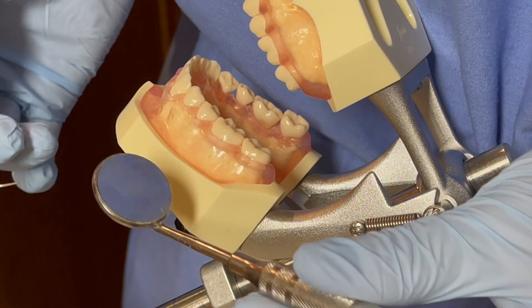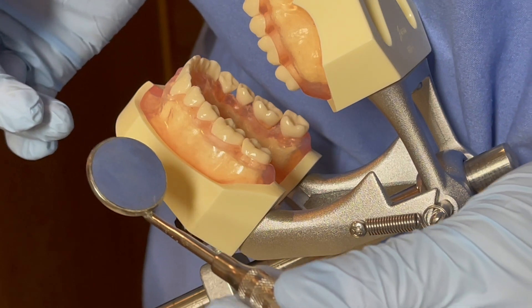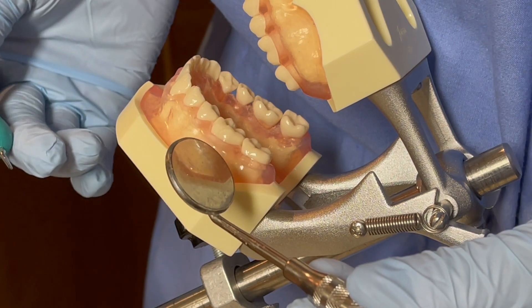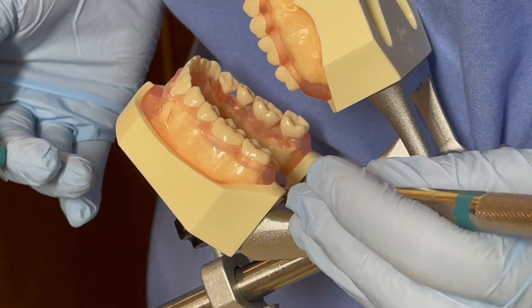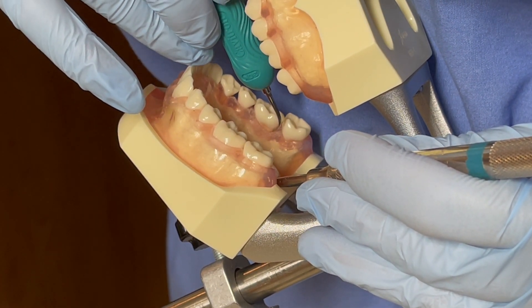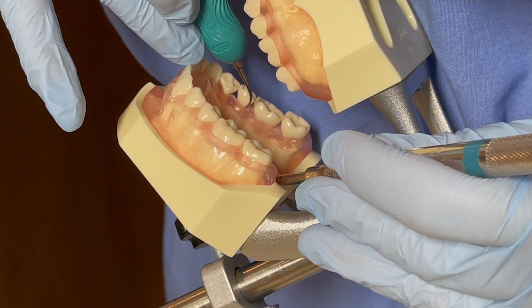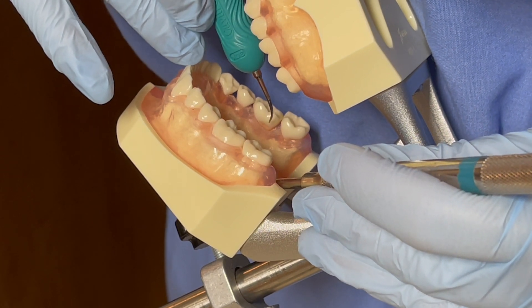For number 29-30 lingual aspects, I will be sitting at 10 to 11 o'clock with the patient in supine position and head tilted towards me. I will repeat the same procedure as the buccal aspect for the lingual aspect of numbers 29 and 30.